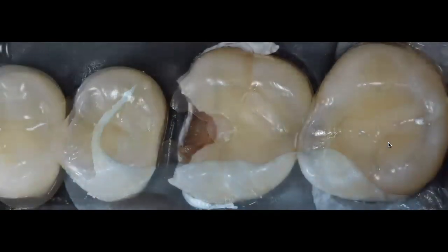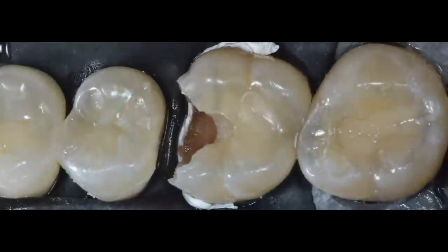before I remove that unsupported enamel. I have now started removing the unsupported enamel. I always recommend placing some Teflon tape to separate the rubber dam from those deep areas, mainly when you have deep caries in your proximal boxes. By placing that Teflon tape into that sulcus between the tooth and the rubber dam, what you're really trying to accomplish is pushing the rubber dam away from that critical area.